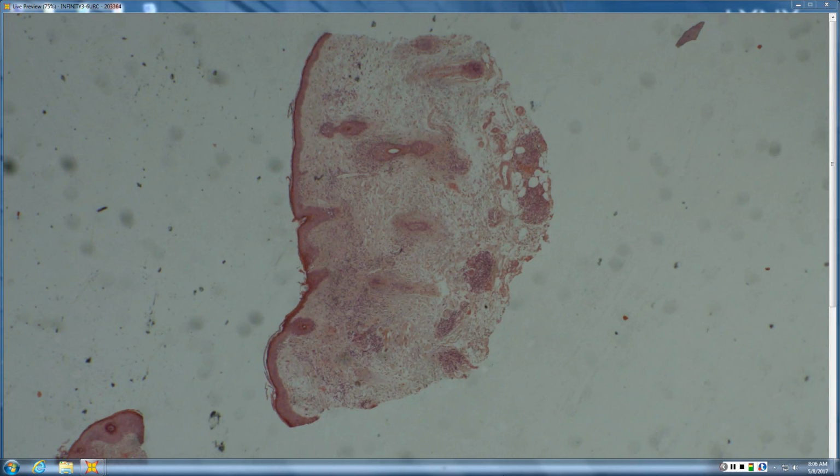Okay. I've seen a lot of hair follicles here. So lots of hair follicles, which could be just anatomic site or could be part of the pathology. If it's anatomic site, where do you have lots of little follicles? Like on the face. Yeah, so this is probably head and neck, face, ear, that kind of thing.